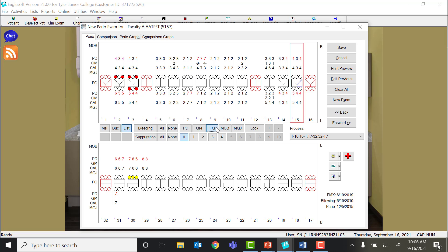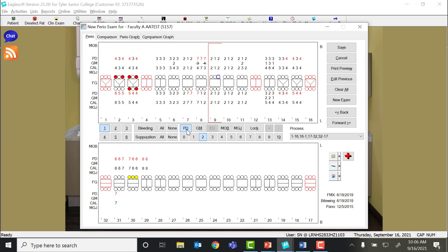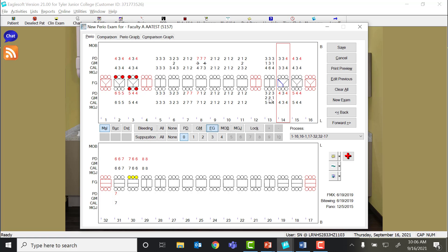Furcation grade also gives you options 0-4, and you would select the actual furcation location. Notice on the anterior teeth that it's not an option. It went back to probe depth. You can only select furcation grade on a tooth that actually has a furca. So when I click on an anterior tooth, that option goes away.